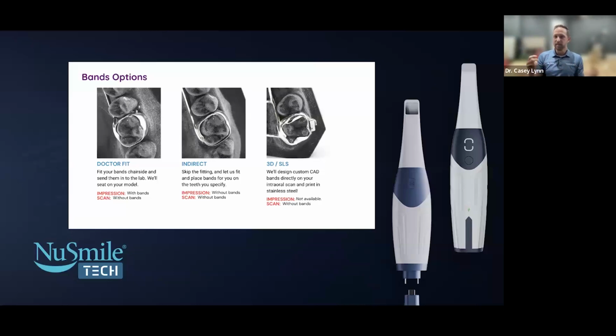The only downside you're going to get, just like any other cementation, is they don't like the taste of the glue, but there's no stimulation to the tissue, and it makes it a much easier cementation process. Even if it is a patient that I did sedation on to do the dental work, I can cement that appliance without having a big uproar in the office. And this one, it's just a scan and send, and it comes back a perfect fit every time and allows you to just kind of plop it on.